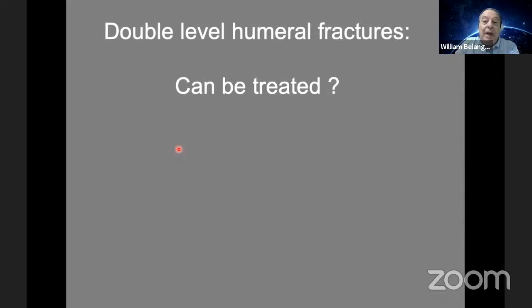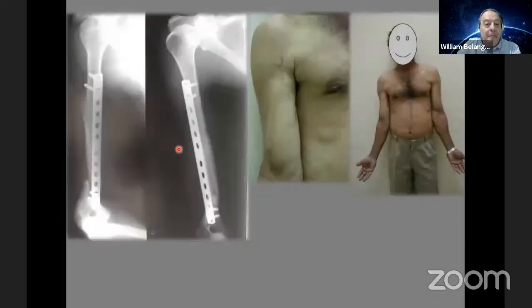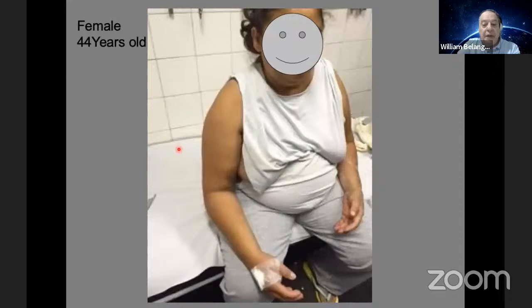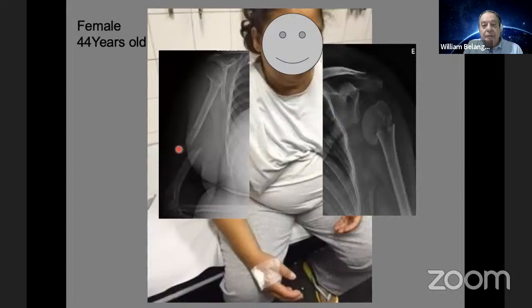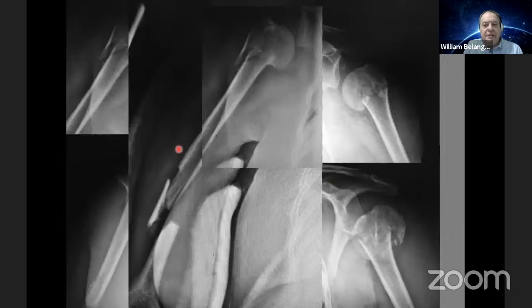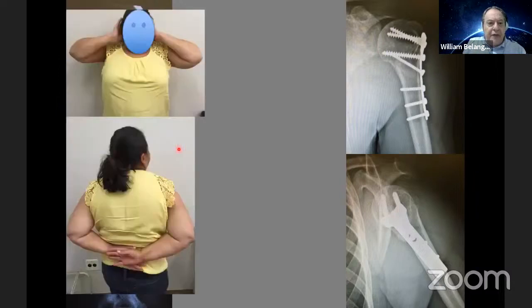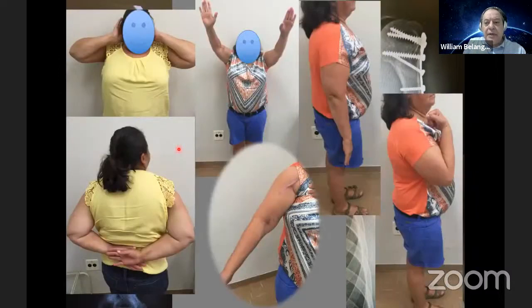We can treat double level humeral fractures. Yes, this is an example. Very good bone consolidation, bone healing. This is another example, both a proximal humeral fracture and a diaphyseal fracture on the right side. These fractures were treated by conventional plates for the proximal fracture, and an anterior bridge plate for the humeral shaft fracture. This is the clinical result.